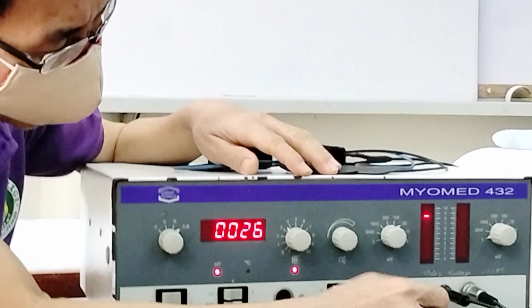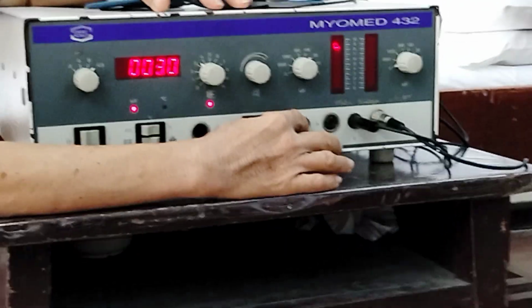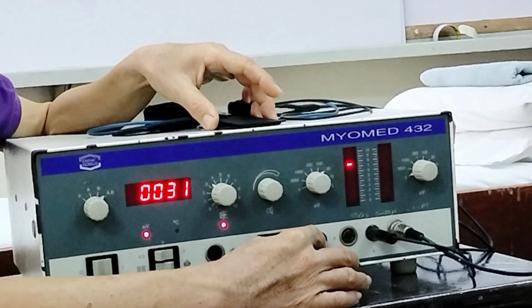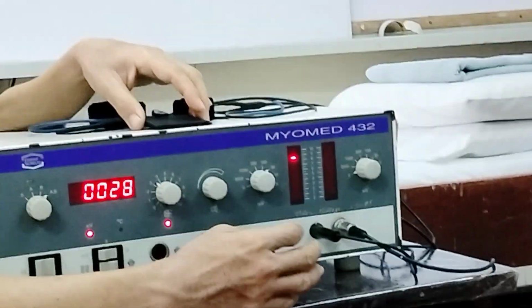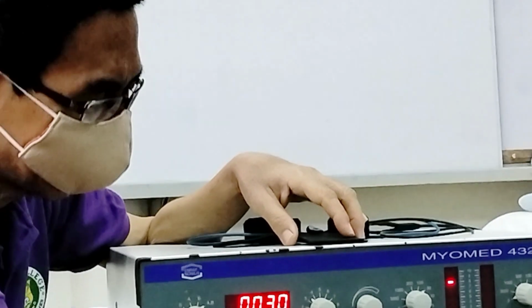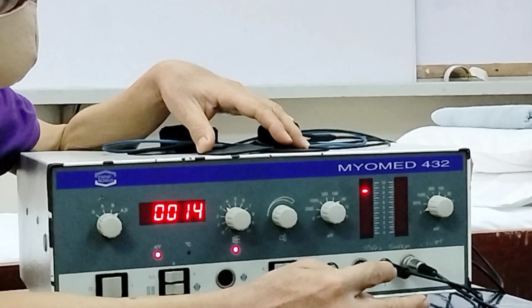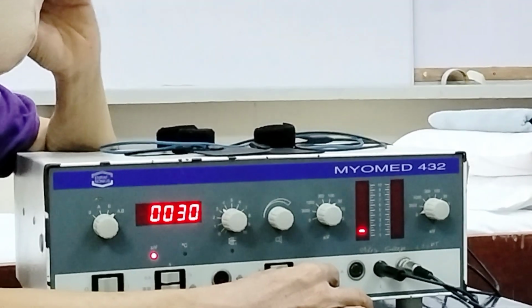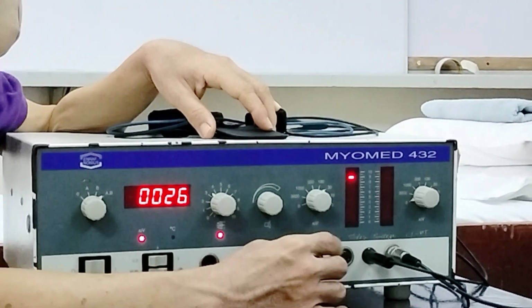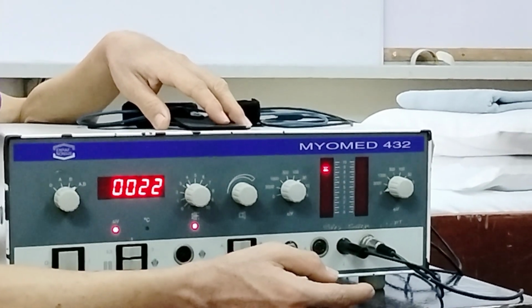In relation to this, there is a socket here for the headphones. Let's say in the center you have lots of patients and you don't want to disturb the other patients. You can just insert the cable of the headphone here and place the headphone on the patient, and only the patient can hear the sound. So the other patients will not be disturbed. Okay? Any questions at the moment?